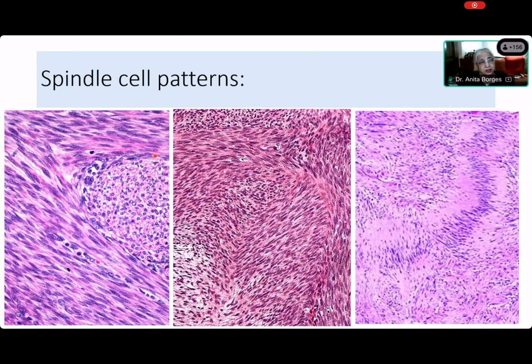Slender bundles. Here's a bundle. I had outlined that bundle, right, Saida? I told you this. We said that bundle was cut at right angles. At right angles, so it's not a slender bundle. So slender has got nothing to do with the definition of a fascicle. So what is the definition of a fascicle?